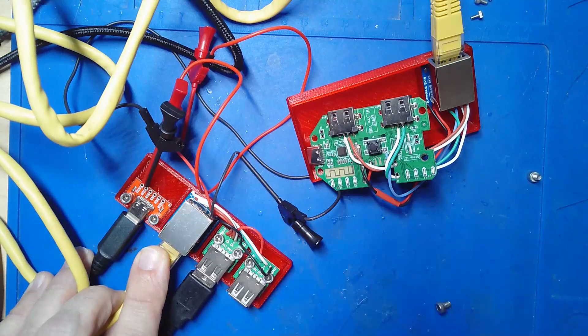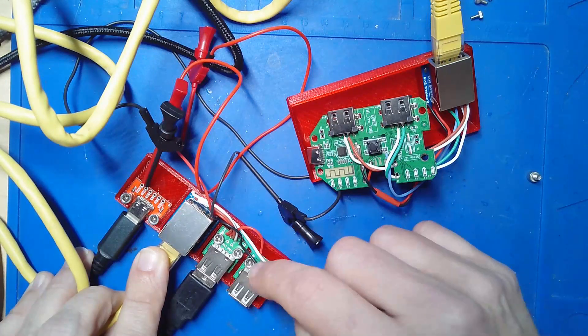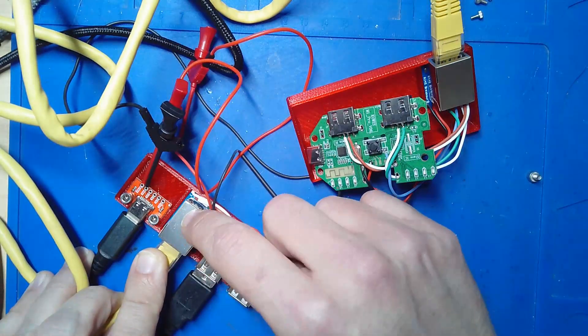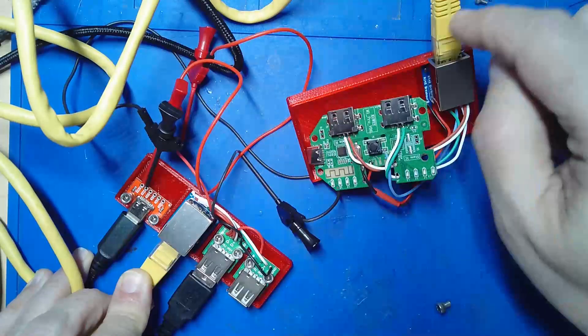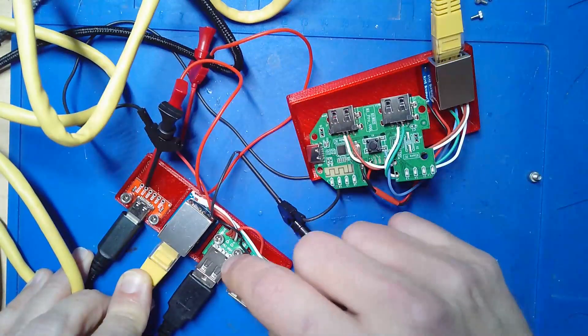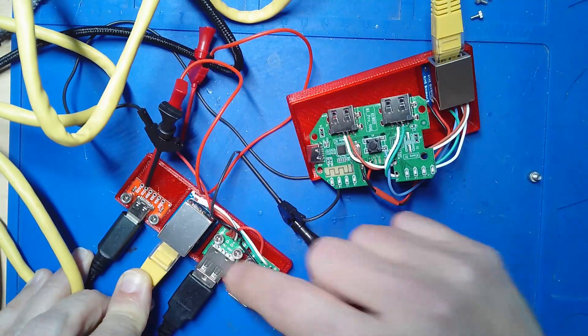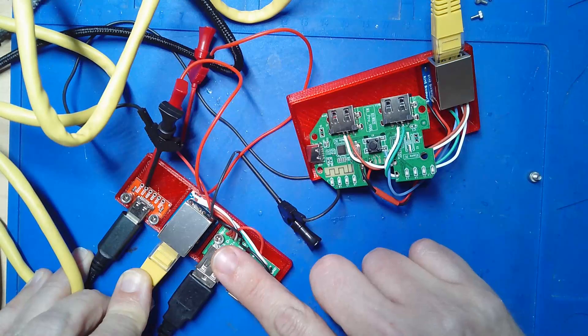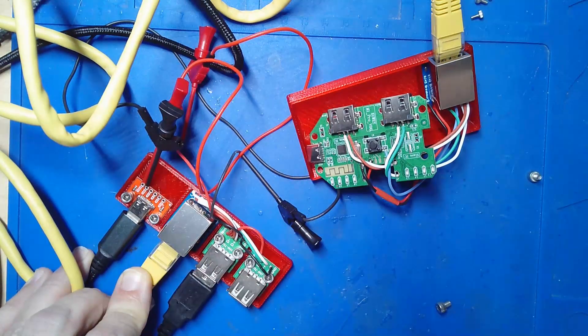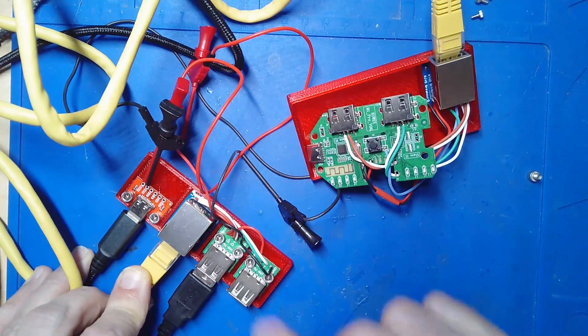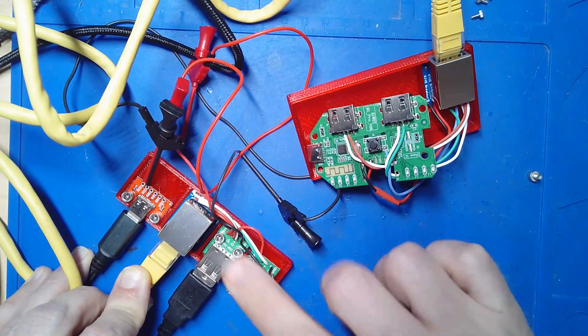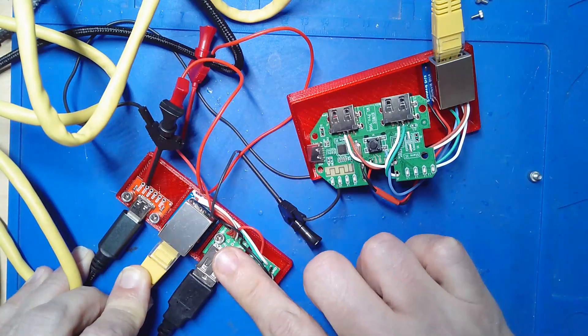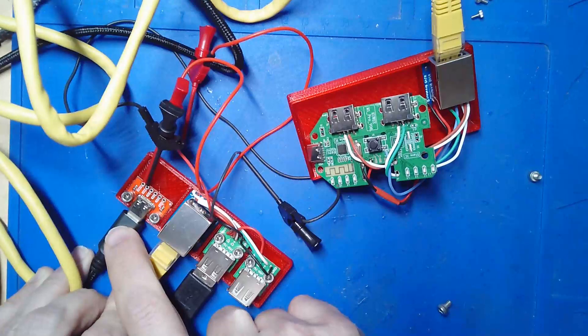So the user will plug in the network cable up to the head unit. They will plug in their mouse and their keyboard or whatever equivalent. This particular user uses an Intellikeys often, so it'd probably be an Intellikeys tied into here. And then provide this power.